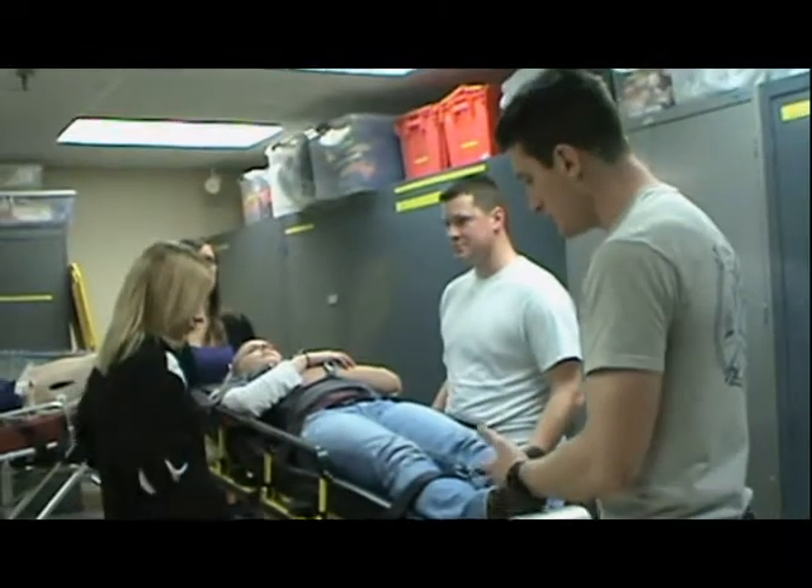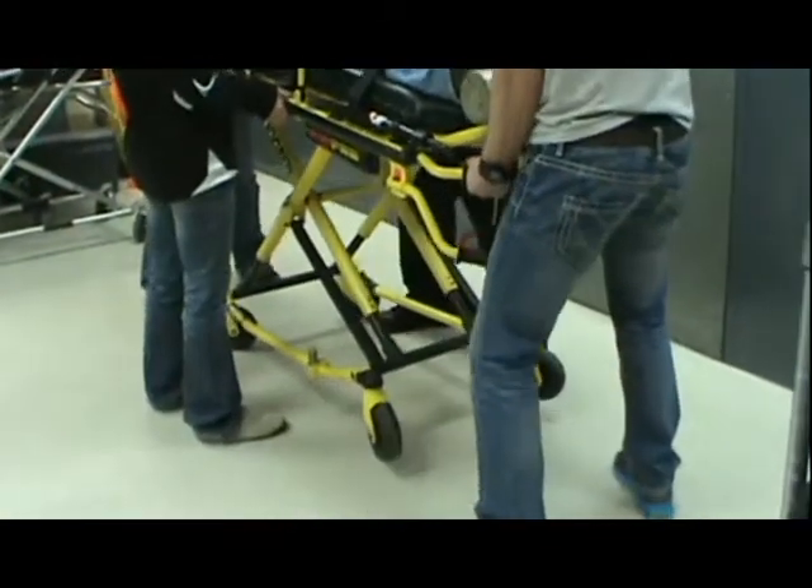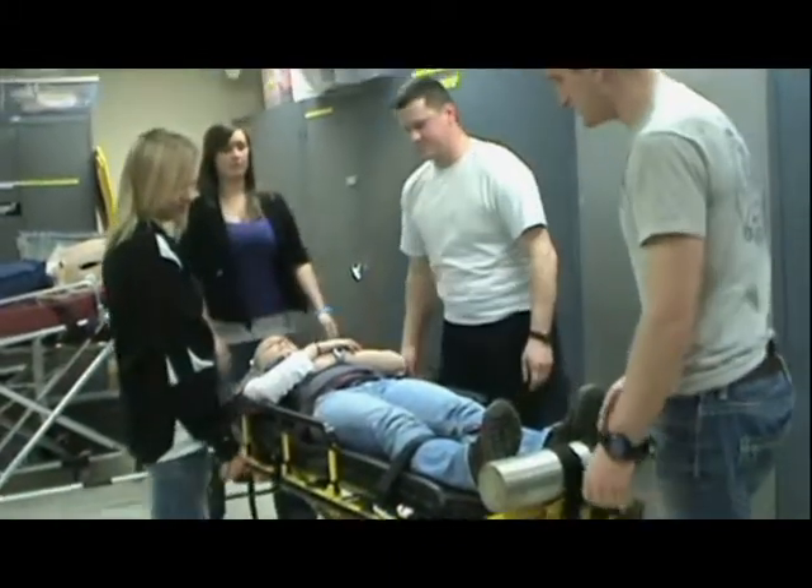We're going to lower her to the transport position. On one, two, three — up and down, and let go. And now she's in the transport position.